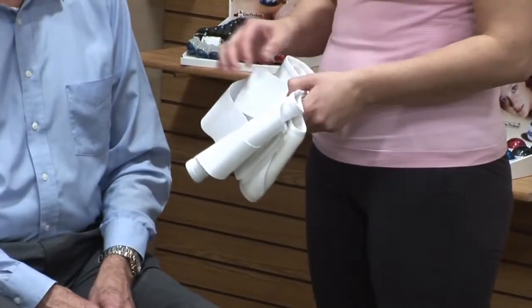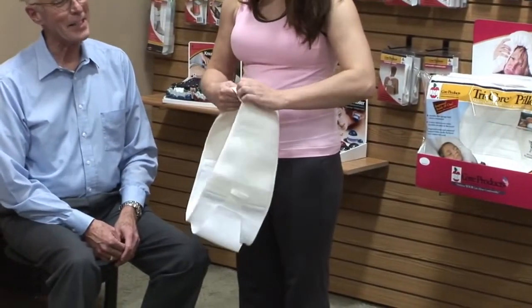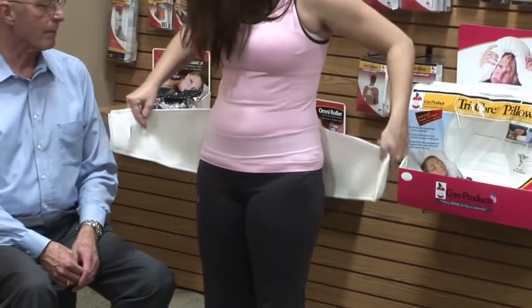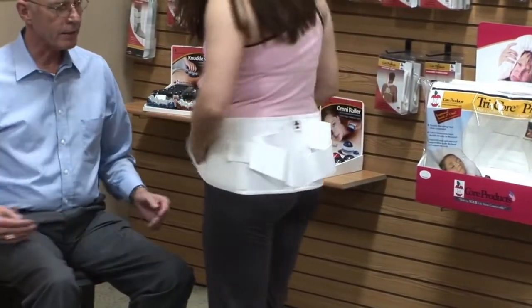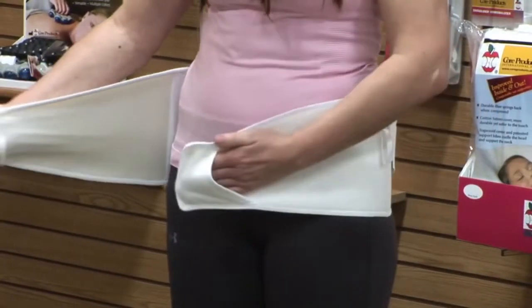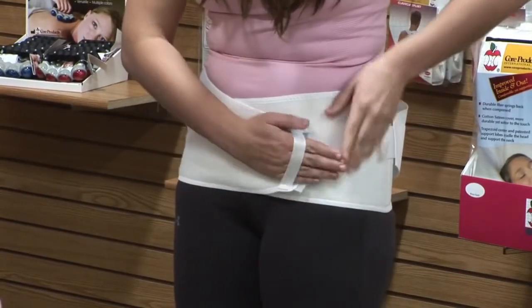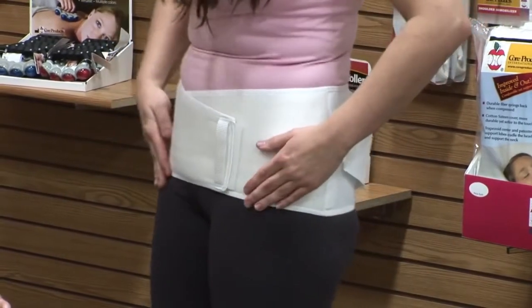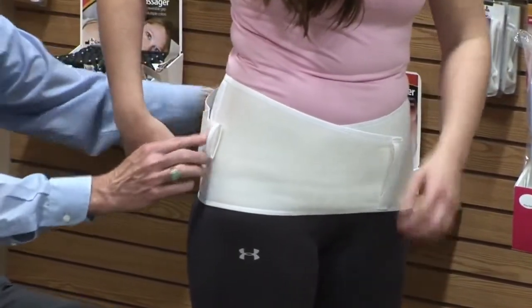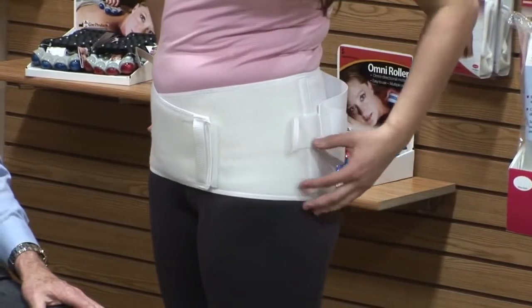We really want the patient to be comfortable using the device, so we ask them to show us how to put it back on. They open it up — getting it right side up is important, with the tabs on top. Teach the patient to pull it out to the side rather than just wrapping it around, then touch it down in front by bringing it out. This removes friction and gives much better compression on the closure.